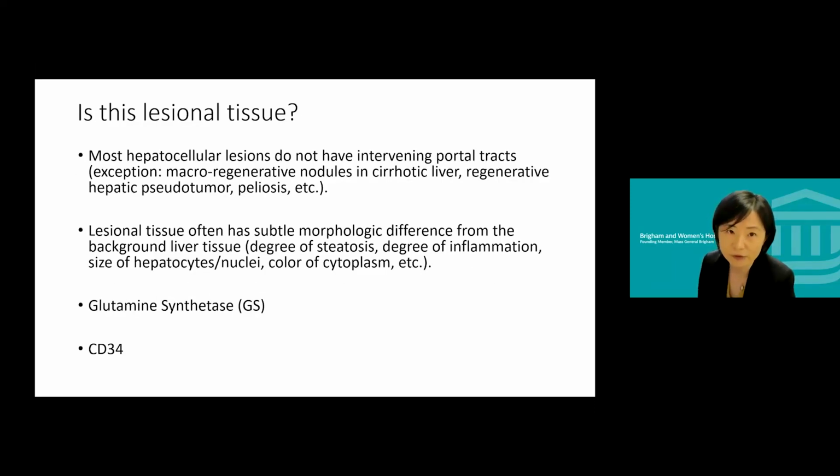So I think the first thing we need to decide is, is there lesional tissue in this sample? And if there is lesional tissue, where is it? There are a few clues you can use.